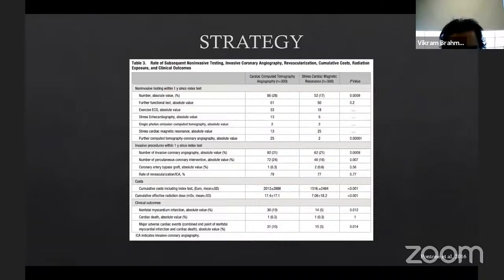If you have calcified lesions, it can be really difficult to tell what's obstructive and what's not. And in my limited experience with FFR CT, it can still be difficult. Sometimes heavily calcified lesions are challenging, but with MRI, that really wouldn't be a problem. So these types of studies, I think, would be really interesting to see in the US.